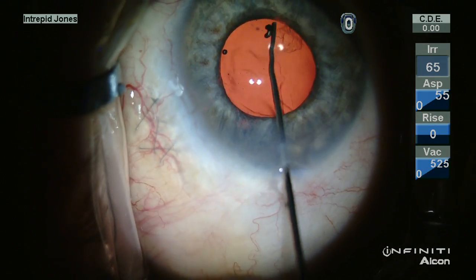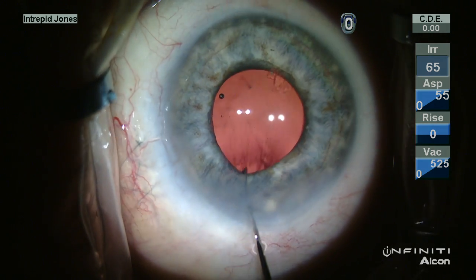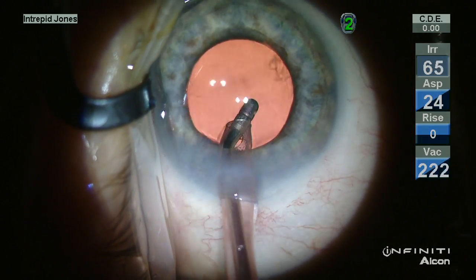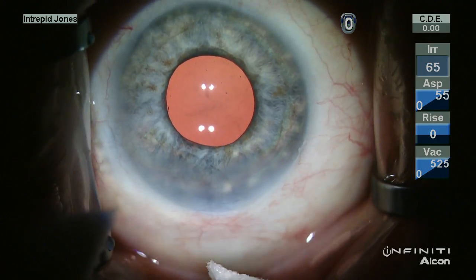I prefer this method as it gives me more control. Now the lens is re-rotated and centers nicely. And once the viscoelastic is removed again, we can see the lens remains nicely centered. Now the sight is removed.